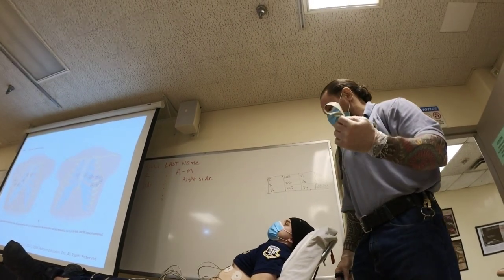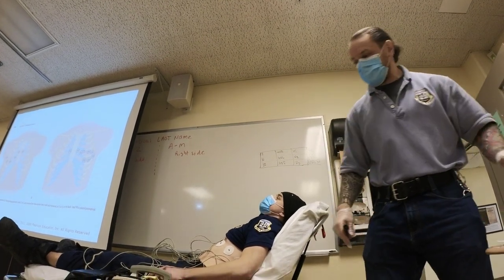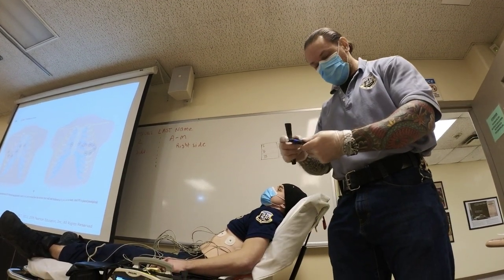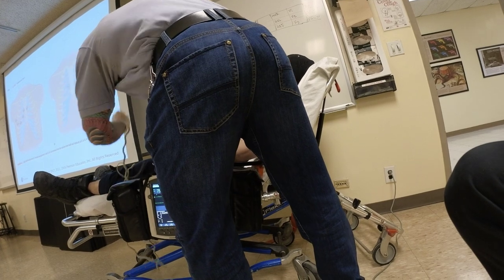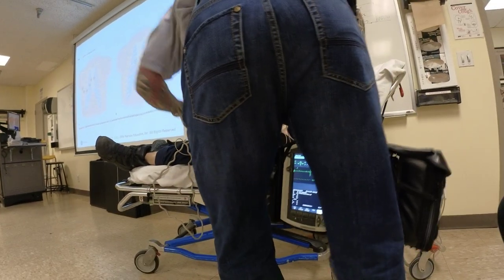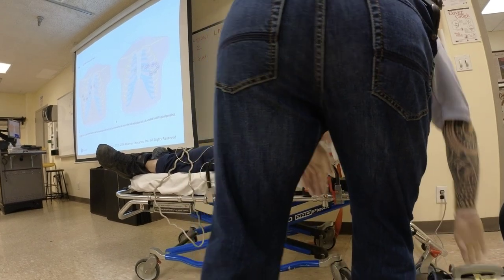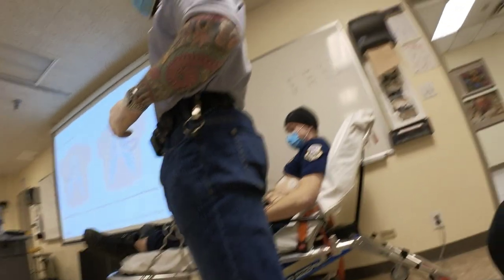So, serial 12 leads. Do not be one of those medics who you arrive to the hospital and you're like, all right, partner, we're right there, right? All right, no problem. Now move this hand for me, sir. All right, perfect. We're gonna walk you in. Right? All right, first, leave this in, and you just take it off. Don't be one of those people.